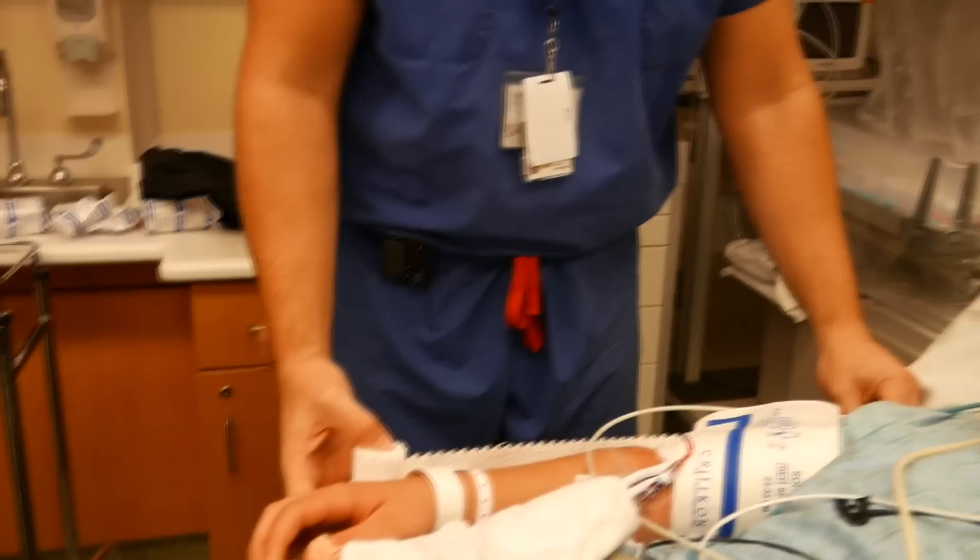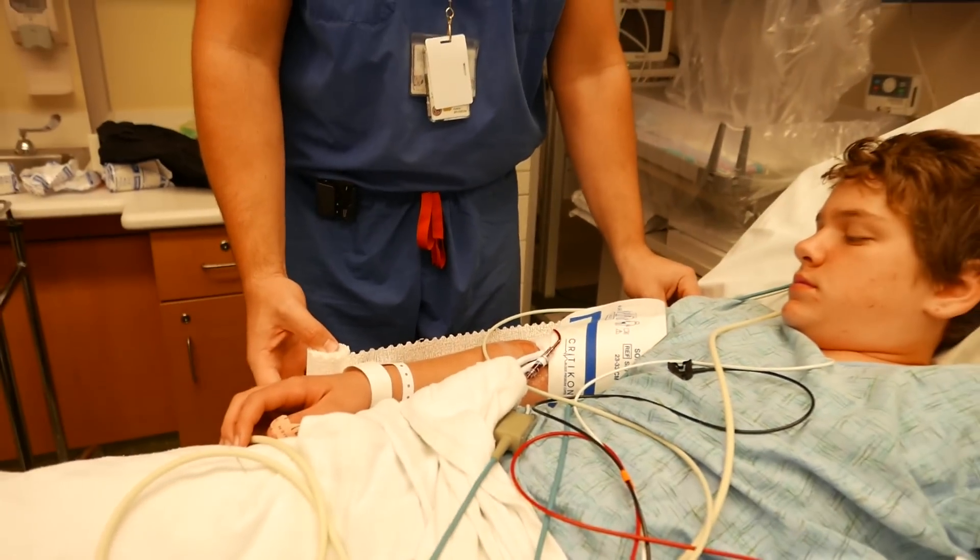We'll measure the splint going from just below the armpit down to the wrist.